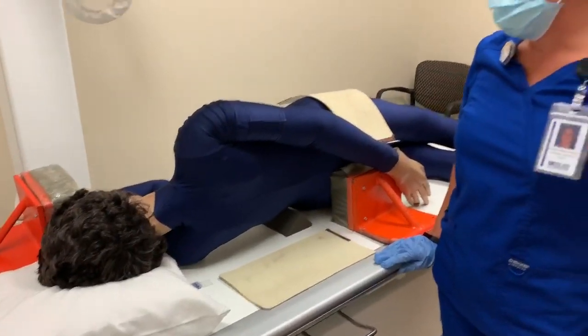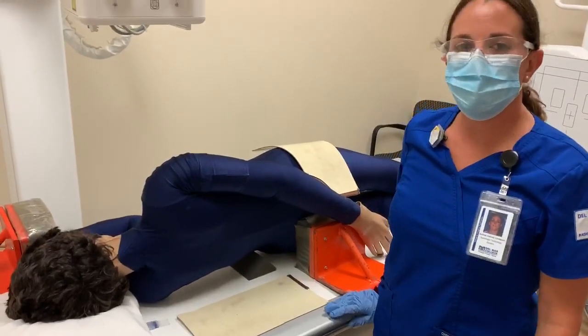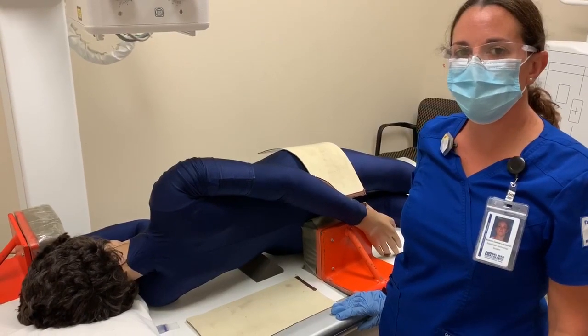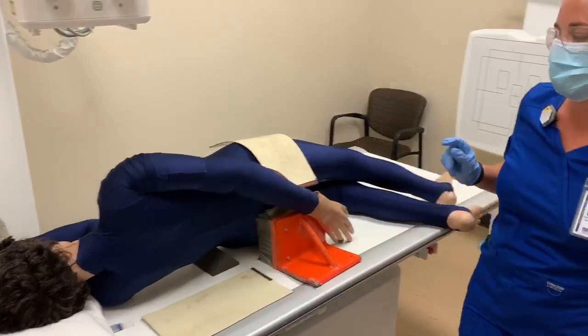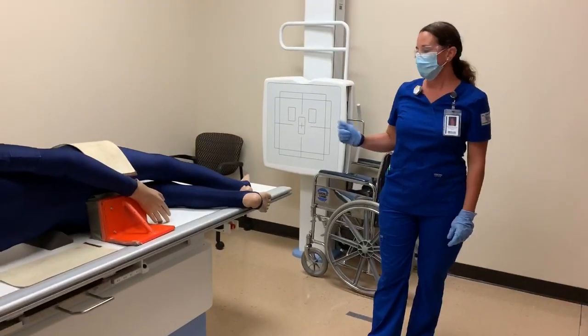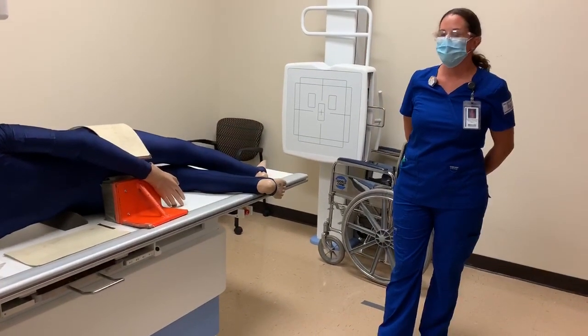The last thing you're going to do is explain the breathing instructions to your patient. And for the swimmers, you want to take the exposure on full expiration. So you're going to ask them to take a deep breath in, let it all out, and take the exposure then. And that pretty much covers the swimmer's position.